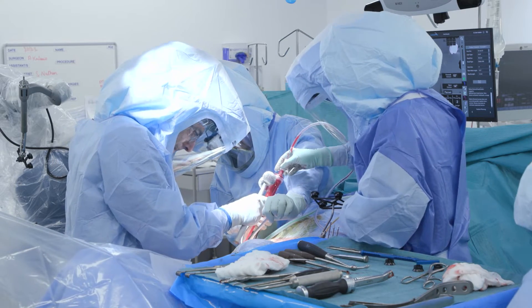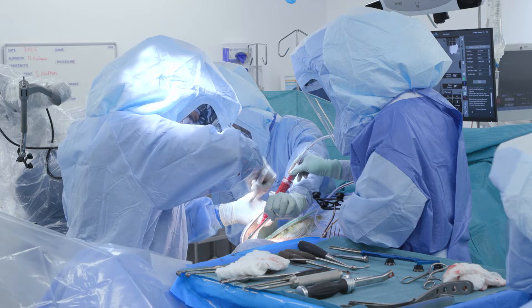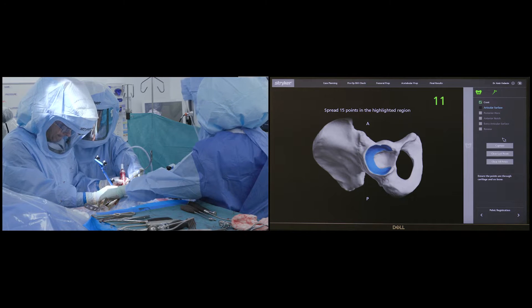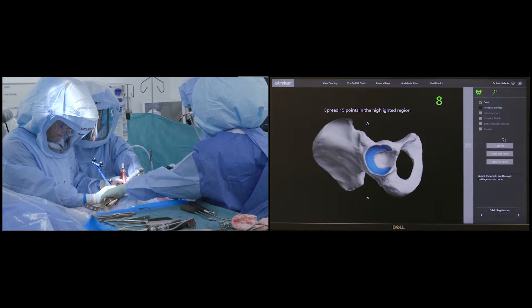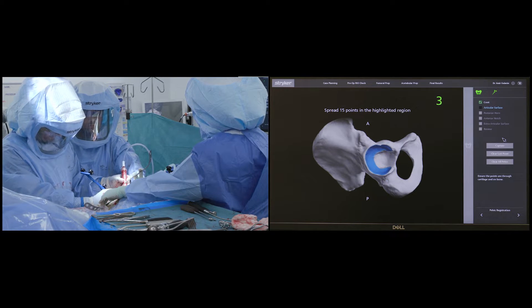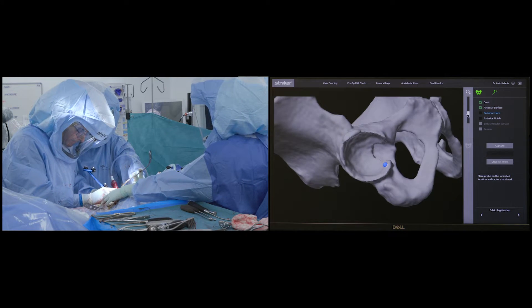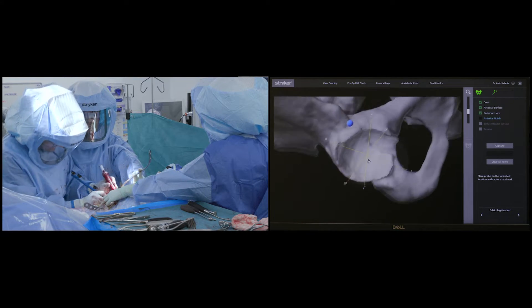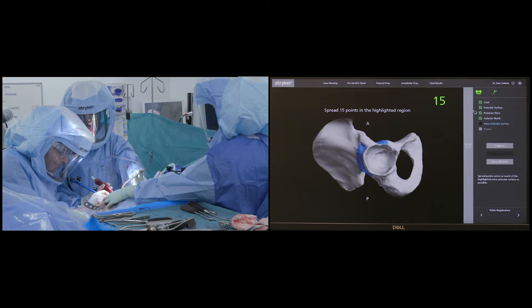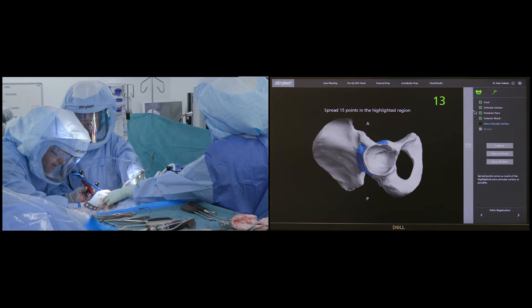Once I am happy with the femoral preparation, attention is turned to the acetabulum. Real-time tracking and mapping of the acetabular bone is carried out and communicated via a specialized pointer to the robotic software. This way the robot can match the patient's real-time bony anatomy to the preoperative CT scan. Once the robot confirms the anatomy has been accurately mapped and matched, the acetabular reaming can begin.